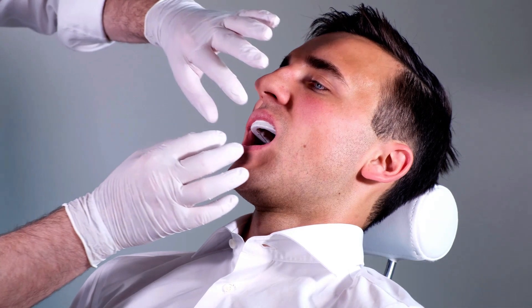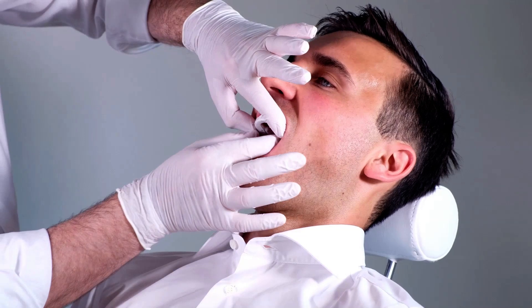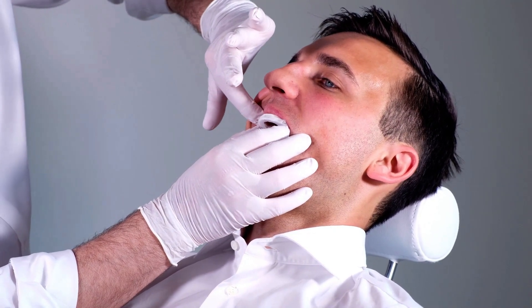With a slightly forward lower jaw, keep the mouth closed for about one and a half minutes. The patient should swallow and gently press the thermoplastic material with their tongue against the inner wall. Meanwhile, let the patient open their mouth and check whether the outer and inner walls of the tray are close to the teeth. Correct if necessary.